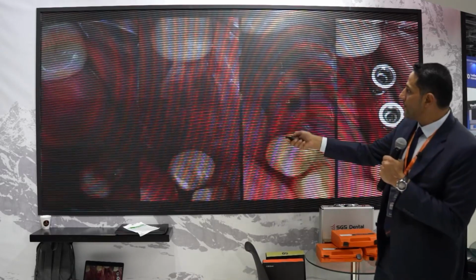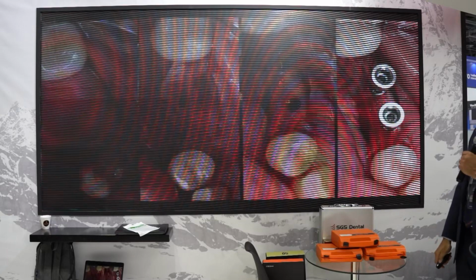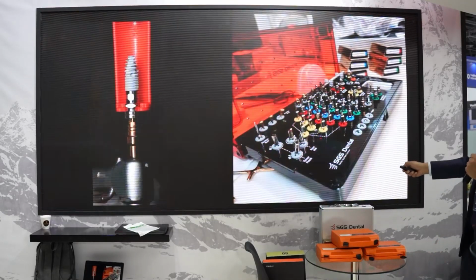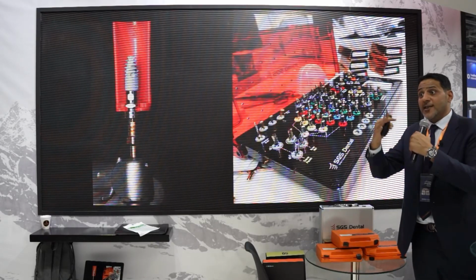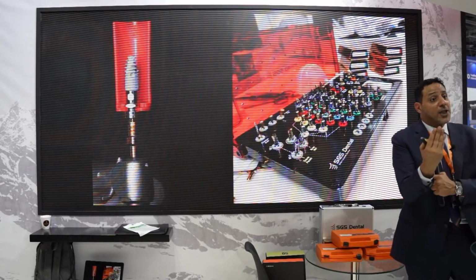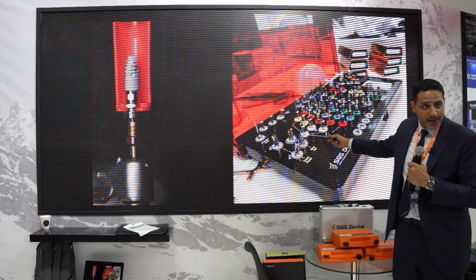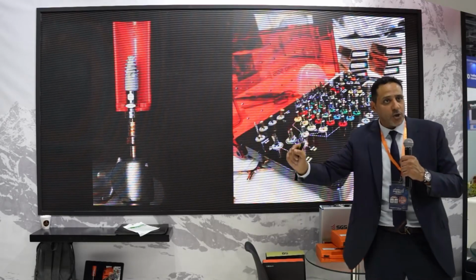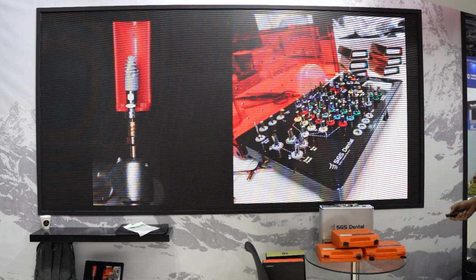Open the flap, drilling, then place the 2 implants. So this is the implant, and this is the surgical kit. In the surgical report, once you print or finalize the design of the implant and the surgical guide, it will have a surgical report. It tells you step by step how to use this guide: what drill you have to start with, the sequence of the drilling, where to stop, and then we have to place the implant.